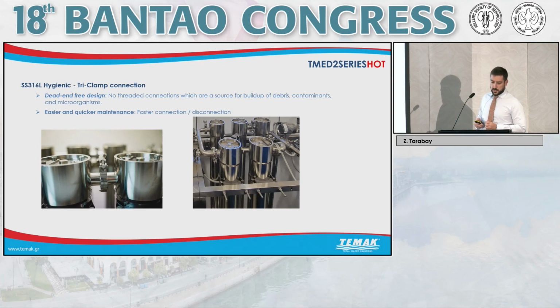Here we also are using 316L hygienic tri-clamp connections. This is a dead-end free design because we don't have any threaded connections, which are a source for buildup of debris and contaminants and microorganisms. Also, it's a useful feature for maintenance purposes because you can easily connect and disconnect it.